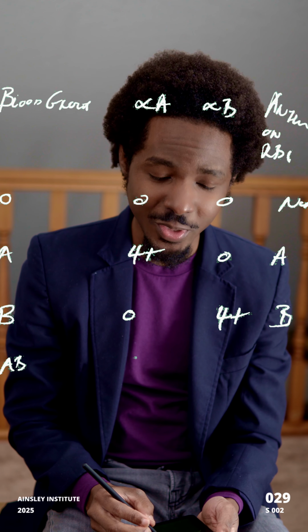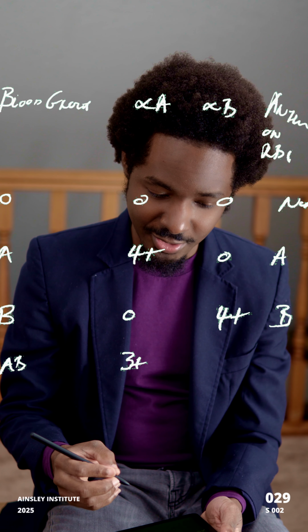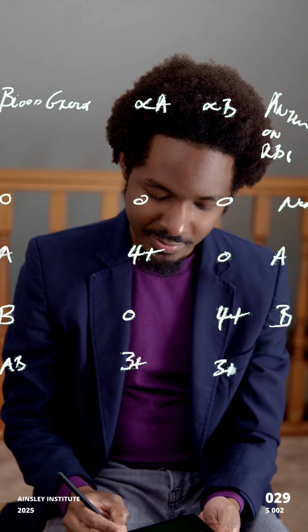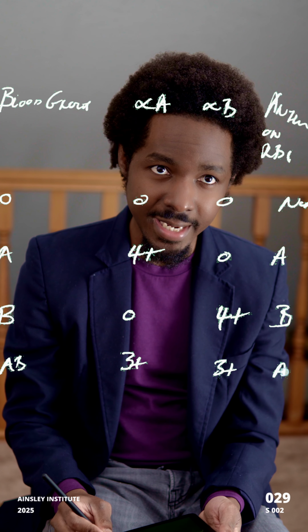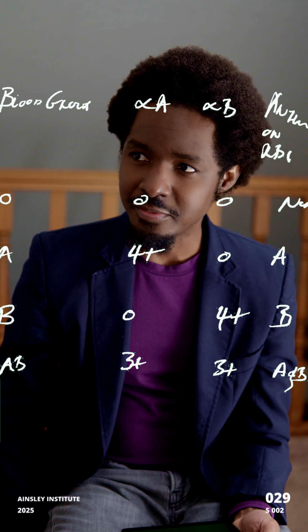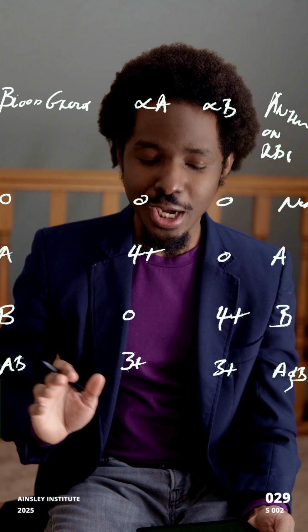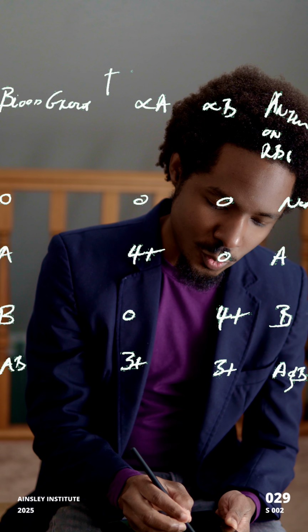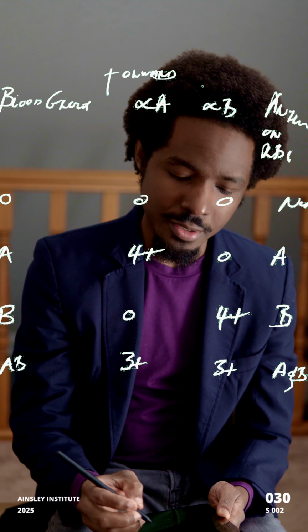We're expecting a reaction with the A, and we have a reaction with the B as expected, because this person has both the A and the B available. All right, so with that observation, with that understanding, we have an appreciation as to what is taking place. Now this is a forward. Let us write it forward, FORWARD. So this is a forward blood grouping.